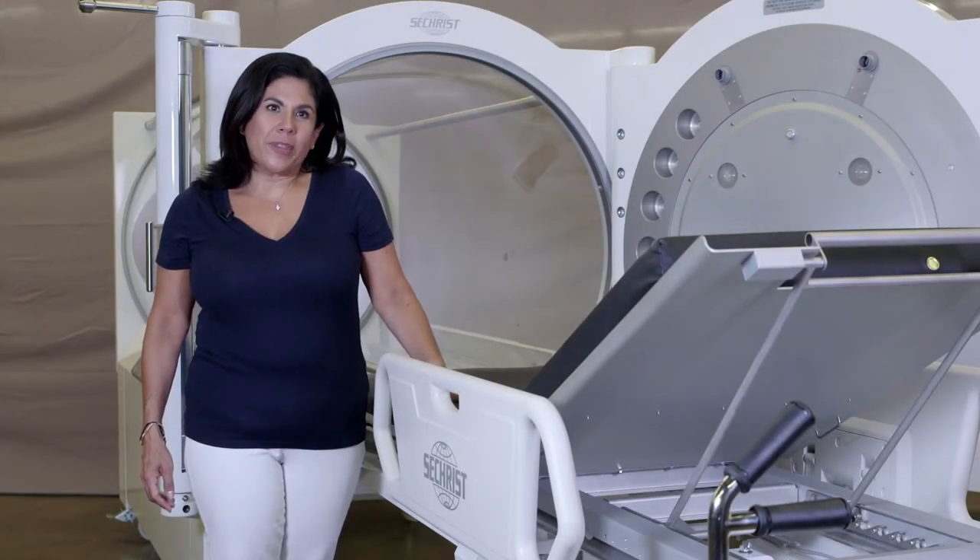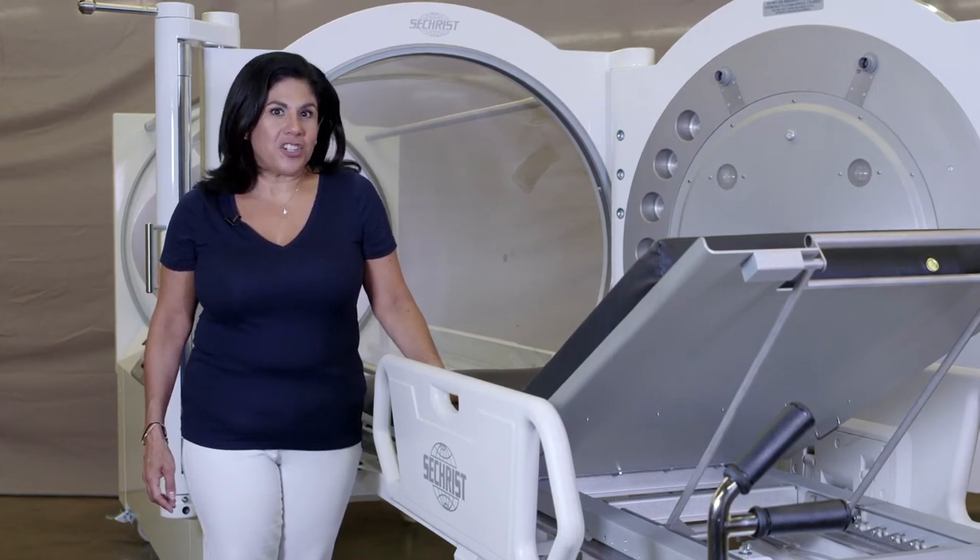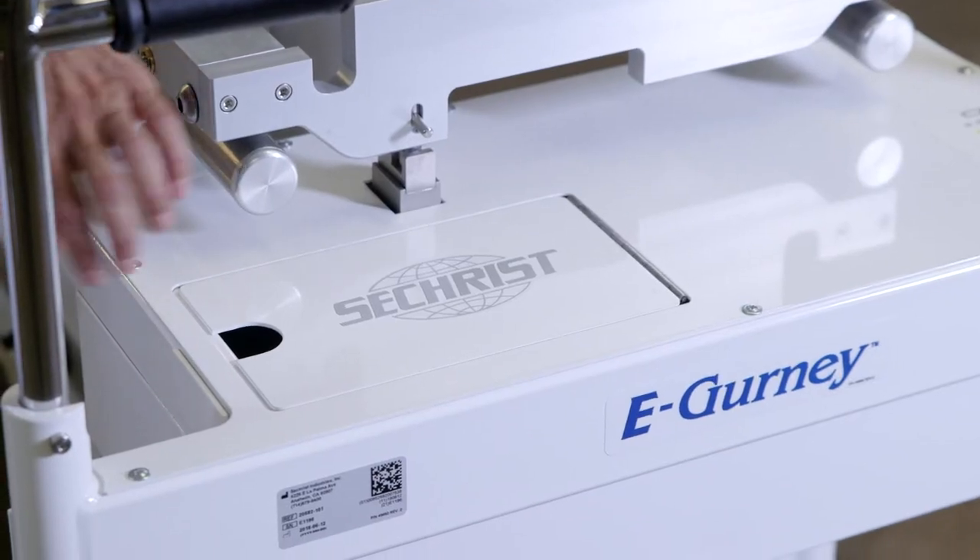Please visually confirm that the four caster system is engaged on all sides to ensure patient safety. Always remember, in order for your casters to work, your battery needs to be plugged in.